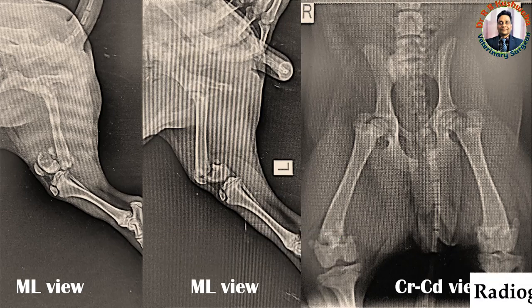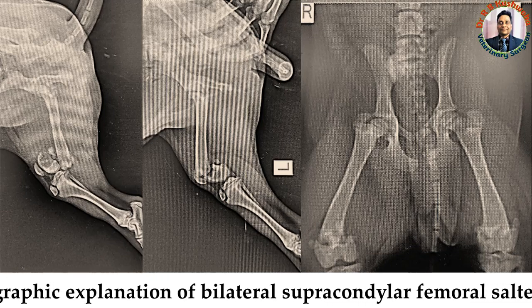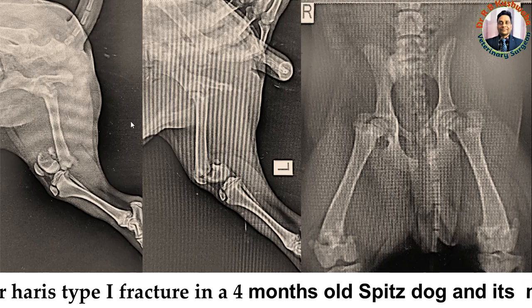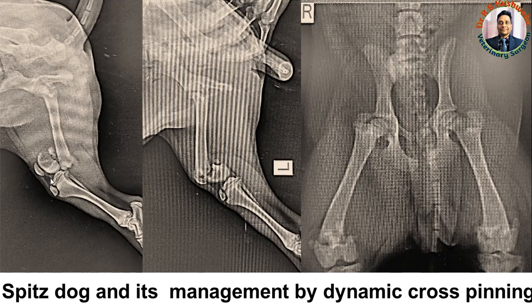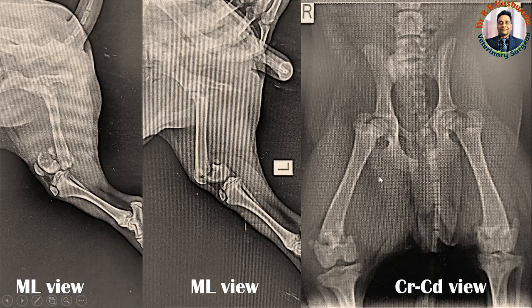Today we are going to discuss the radiographic examination of bilateral supracondylar fracture of the femur bone in a four-month-old Spitz male dog. This dog had a hit injury one day back. You can see the medial-lateral view of the right femur bone, the medial-lateral view of the left femur bone, and the craniocaudal view of both right and left femur bones in a single image.